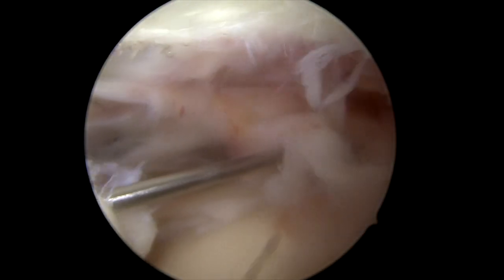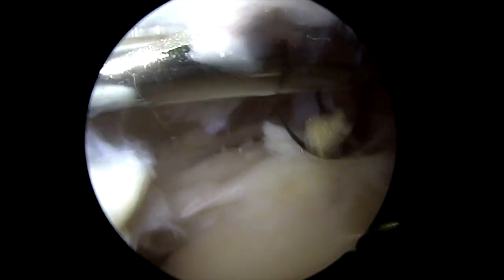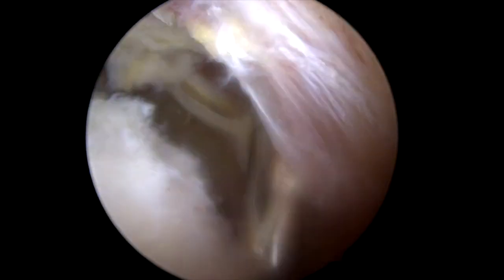You can see all of the inflammation and scar tissue in the shoulder from the tear. This is an instrument called the shaver, and what we're doing here is carefully removing all of that inflammation. This causes pain and it also inhibits us from seeing the tendon so that we can get a perfect repair, so we have to meticulously clean out all of that. That's what's called bursitis.